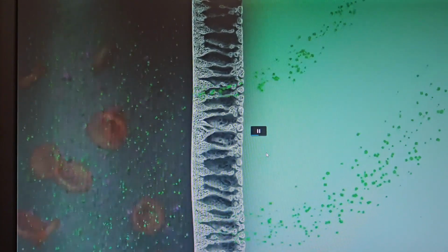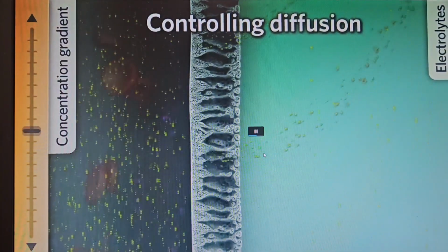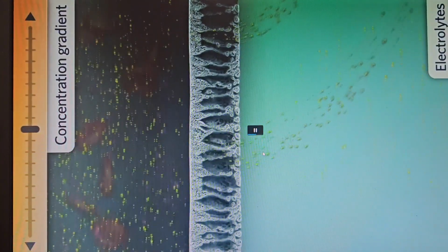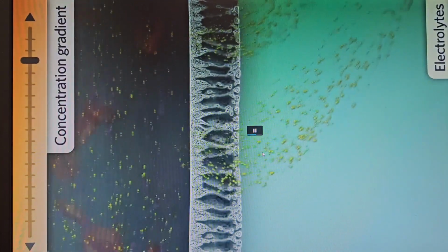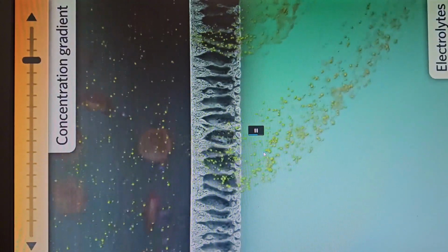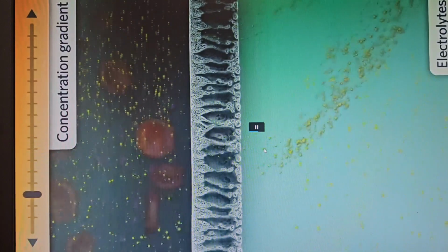dialysate. The amount of electrolytes drawn out of the blood can be controlled by increasing or decreasing the amount of electrolytes in the dialysate. Less of an electrolyte in the dialysate will increase the concentration gradient and thus increase diffusion of the electrolyte out of the blood. More of an electrolyte in the dialysate will decrease its diffusion.